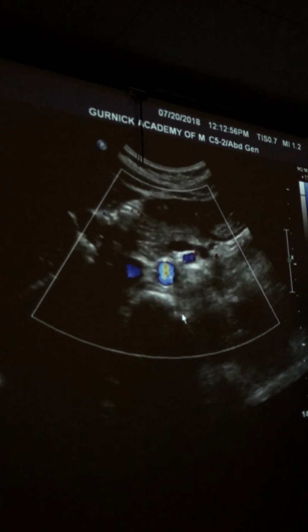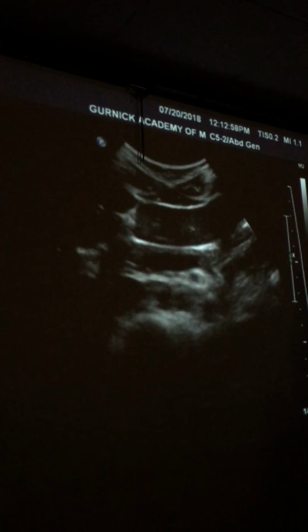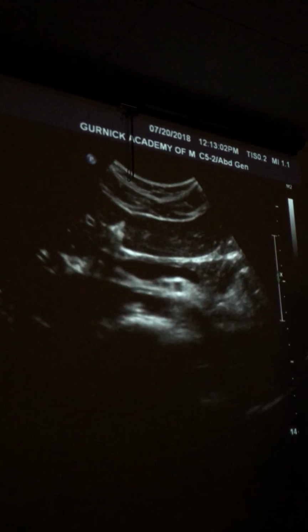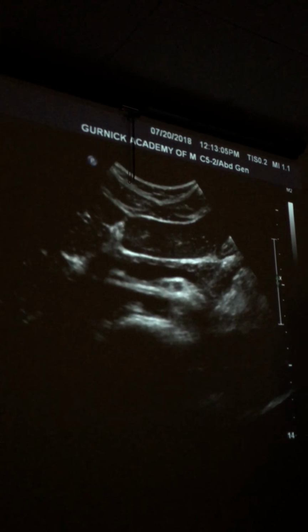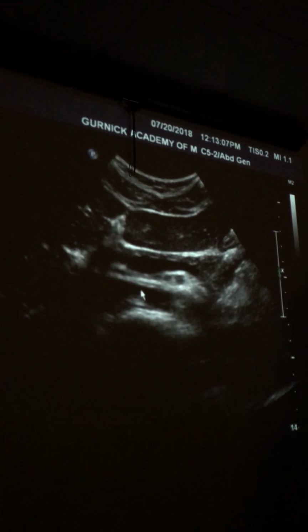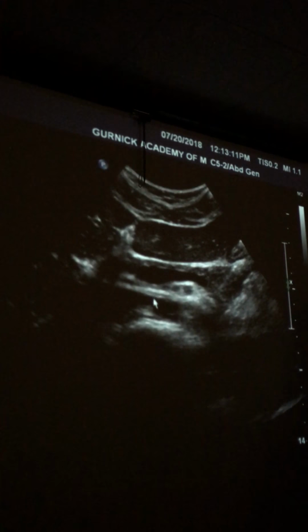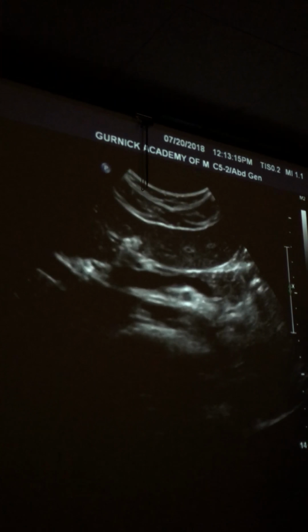Can't find our renal artery. Hold on. I actually find it better without color these days. So here's her, can you see her right renal artery? Yes. It's right here. It looks like it's coming off the IVC, but it's actually not. Notice how straight those lines are. That's the right renal, and the left renal is right next to it.